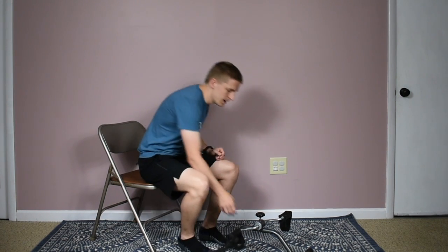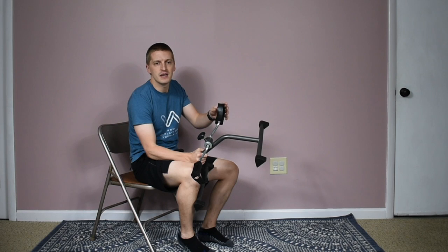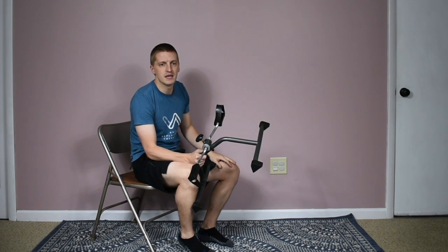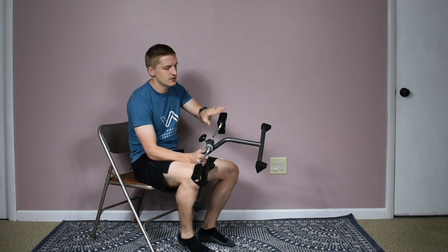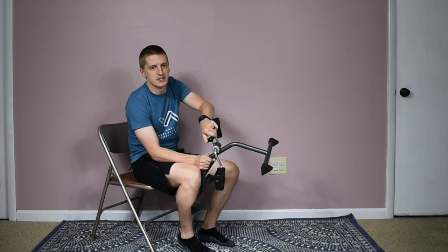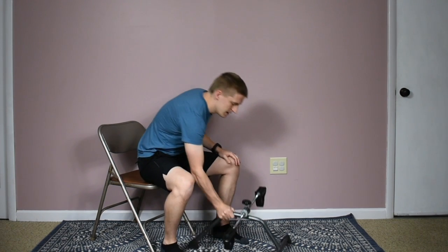Most of these peddlers come with straps. You can use the straps, but if your shoes or feet are a little too big and it's not comfortable to get them in, feel free to just use the other side without the strap — it works just as well, and you can usually do a good job of keeping your foot on the pedal.